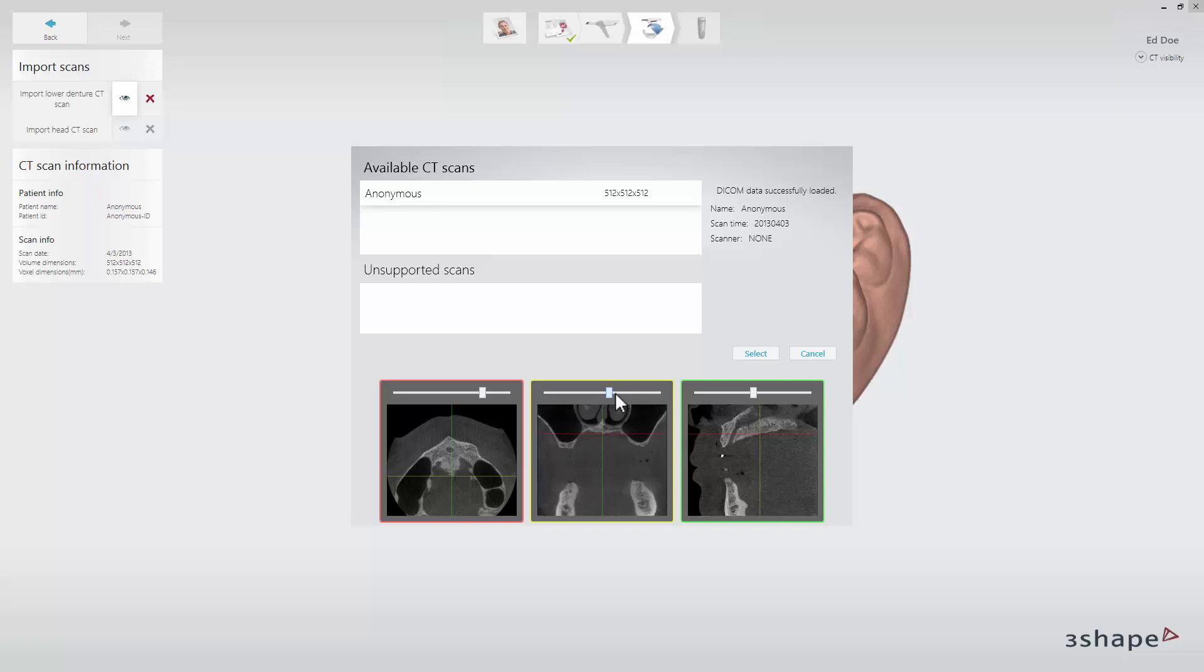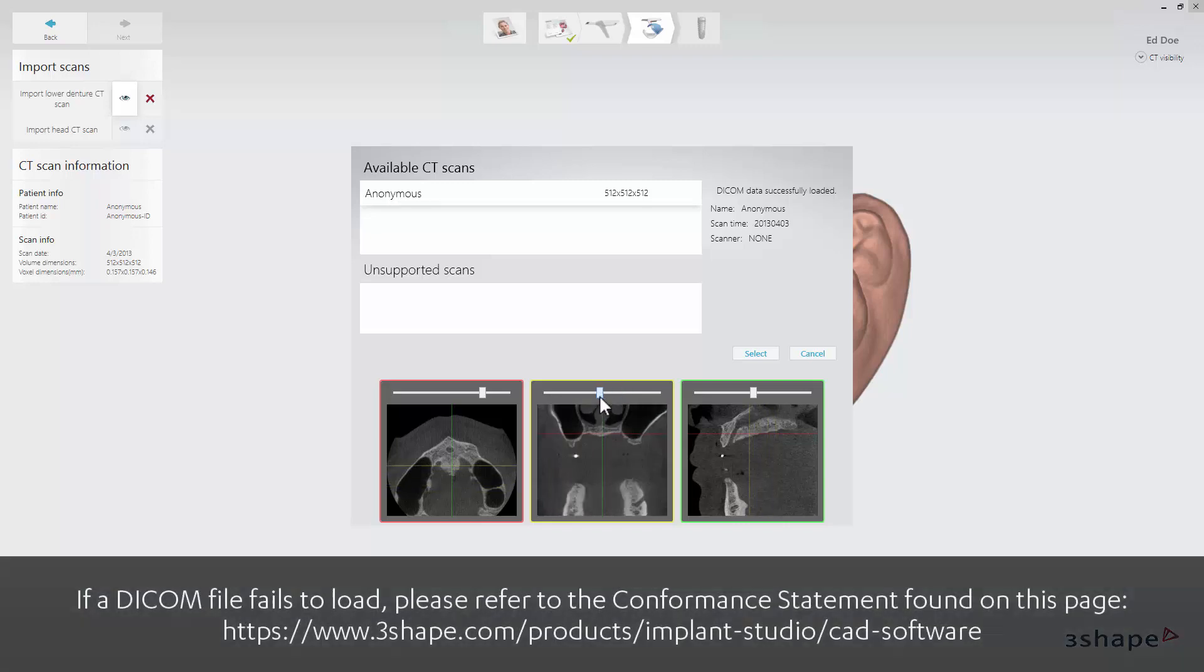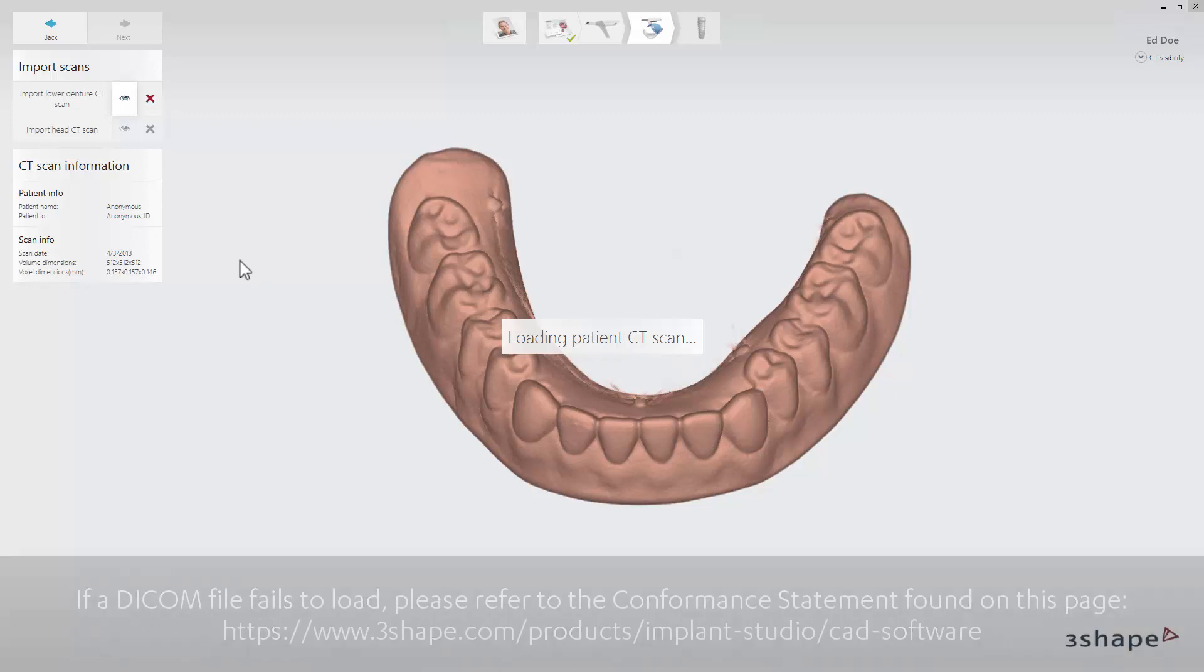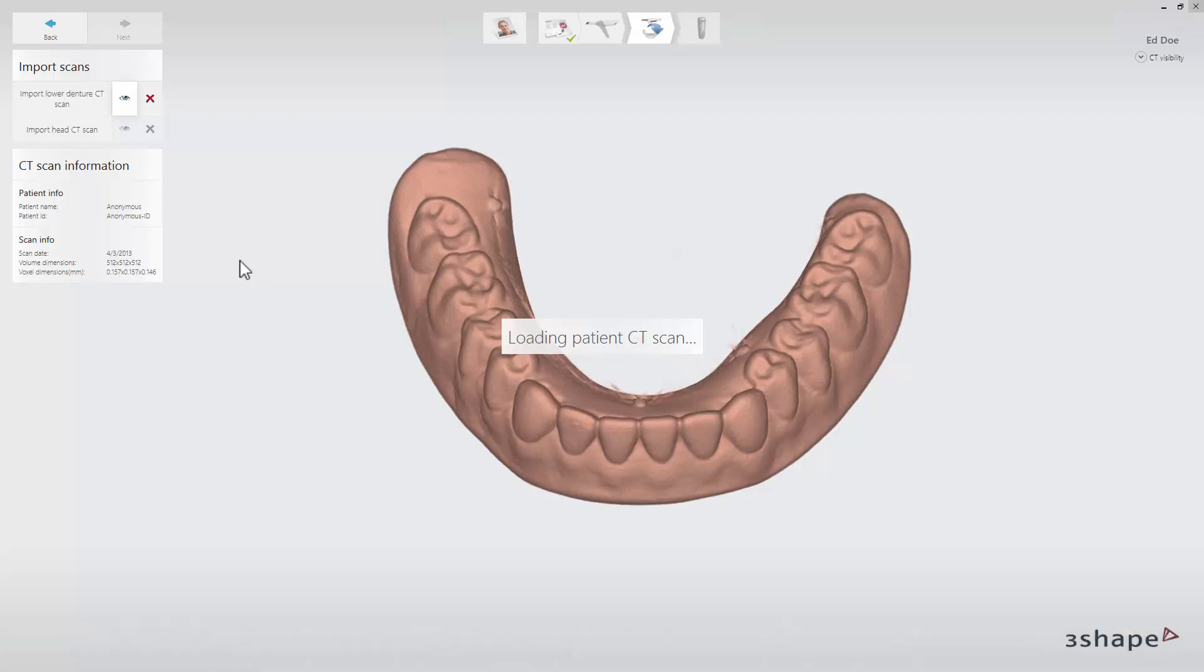If a DICOM file fails to load, please refer to the 3Shape DICOM conformance statement guidelines or alternatively contact your CT manufacturer for clarification. The 3D preview for the head scan will appear on the screen.